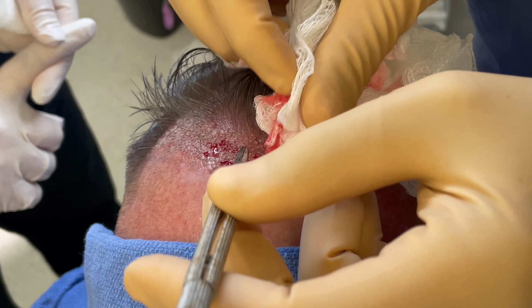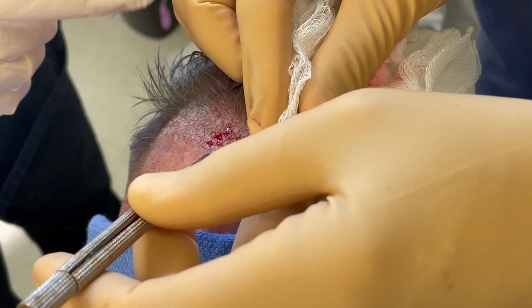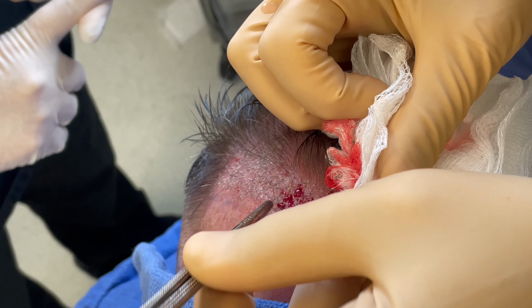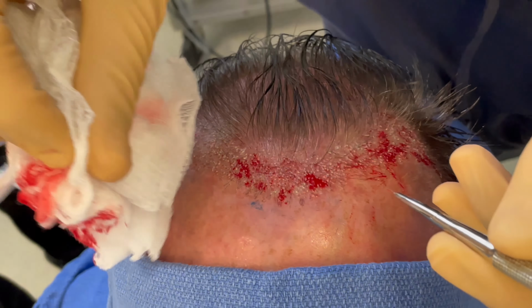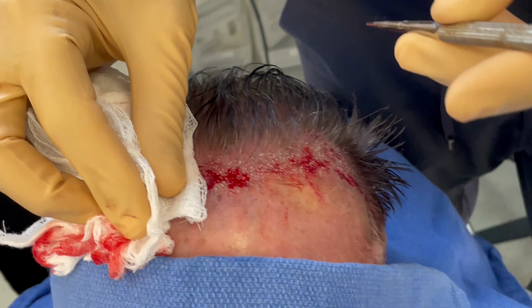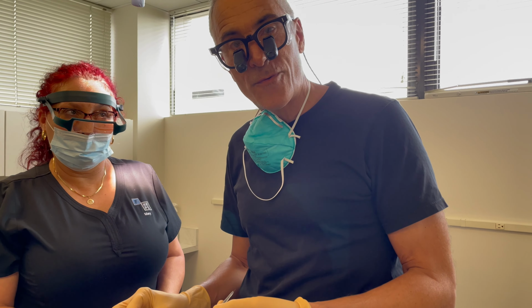So I have an unobstructed view, and other than he's got a little bit of bleeding, not surprising, I'm able to go ahead and make these recipient sites, having a nice, unobstructed view of where the hairs are needed. So that's my tip number 1 and 1A, which is the Benadryl for redness.